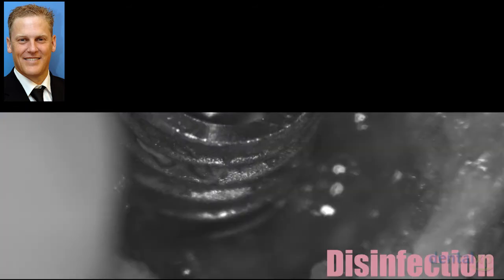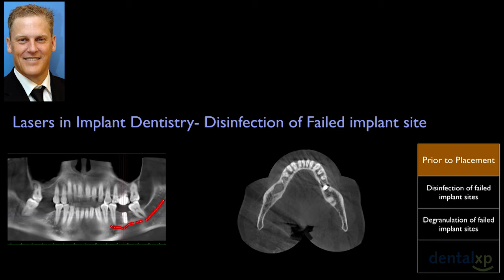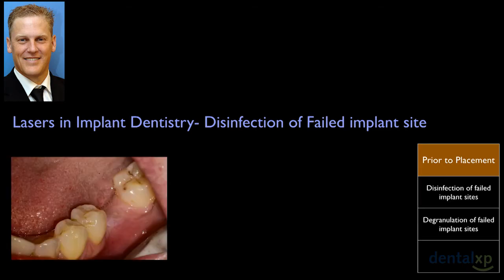Lasers can be used for disinfection, in fact, in implant cases, and I show you this as a precursor to what I'm going to show you a little later on. This particular patient came from another dentist. She'd had an implant placed 3 years previously, but had never had it restored because of persistent pain. She came to see me, and upon the cone beam, you can see that there is a significant radiolucent area on the buccal. The other slice view here shows you the radiolucent area on the buccal, and the decision was made to open it up and see what we had because there was chronic exudate coming out.